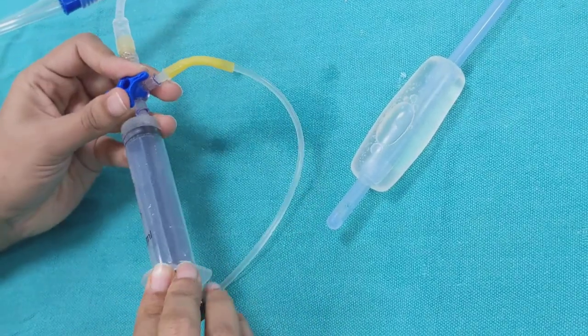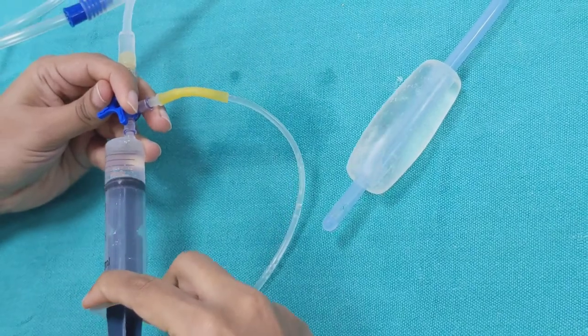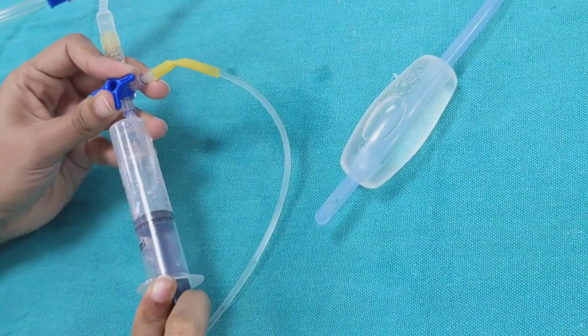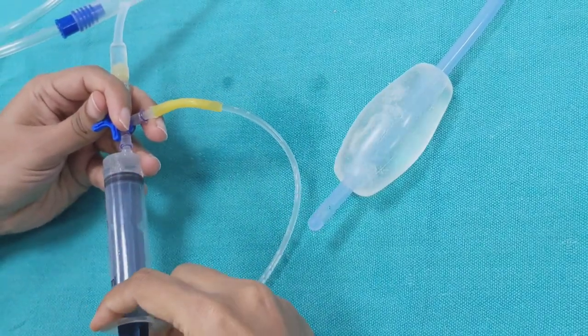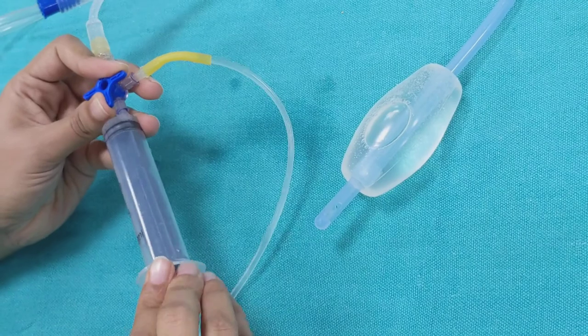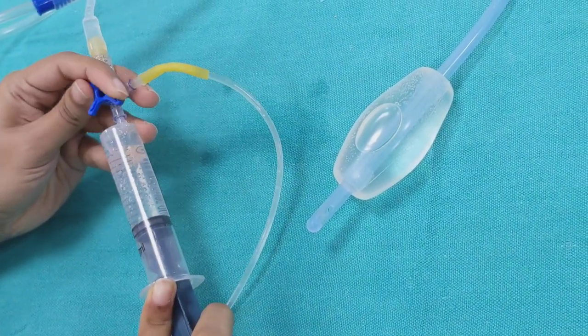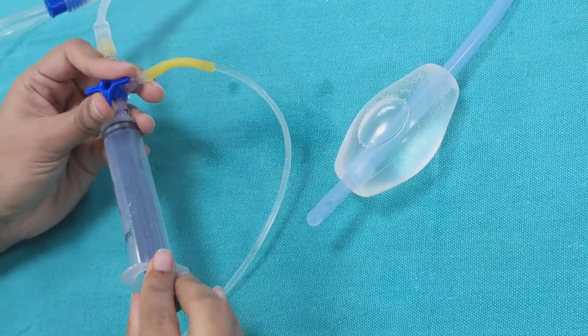As you can see, the balloon is getting inflated. Connecting an IV line like this saves a lot of time. Instead of this, you can also take help of an assistant who fills the syringe for you, but that would be a little time consuming.